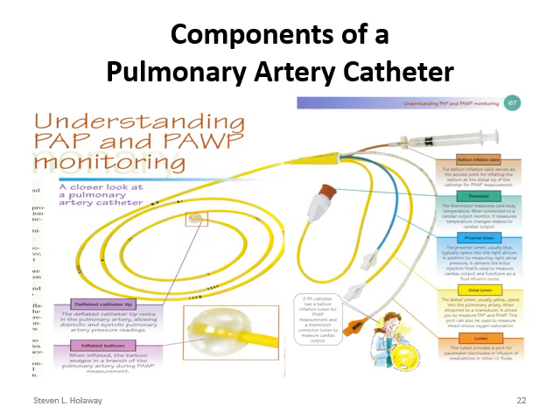Anytime that we are not using the balloon, don't have the balloon up, this basically needs to be locked off, and there should be no air in the syringe. So the syringe should be taken off, air forced out of it, connected back up, and the stopcock or the slide lock in the locked position.